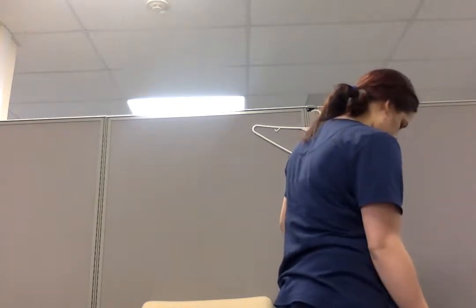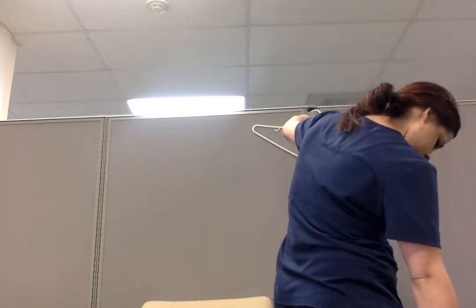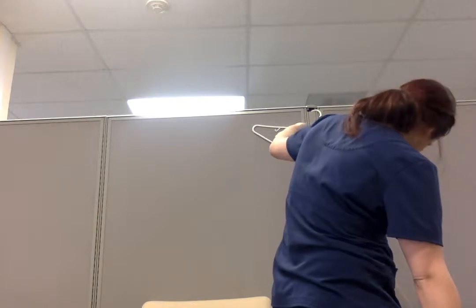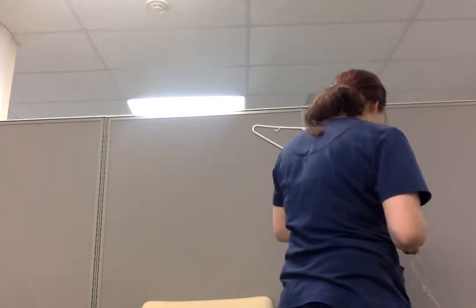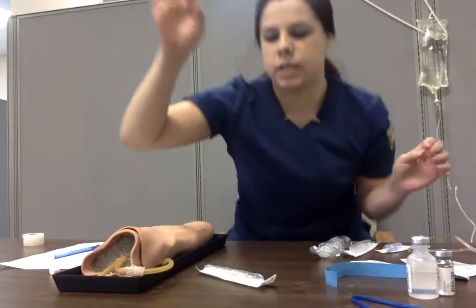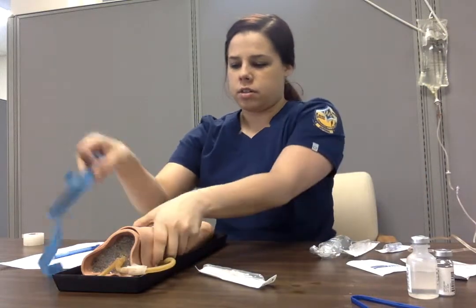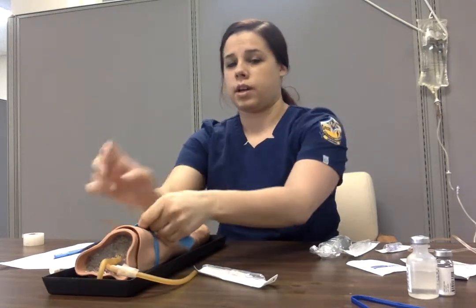You need to fill the tubing so there's no bubbles. And I would set my drip factor to, or I would just let that be for now. And I'd wash my hands, I'd put non-latex gloves on, and I would tell him I'm going to start his IV. So I'd put the tourniquet on and see if I could feel, when I had it on, see if I could feel a radial pulse.